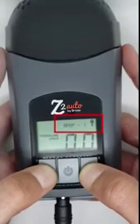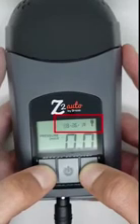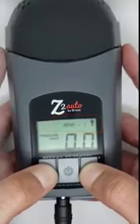Also in the upper right corner, you will see the power source displayed. If it is plugged into an outlet, a plug will be displayed. If it is plugged into the power shell, a battery life indicator will be displayed. Next, we will now need to unlock the device.